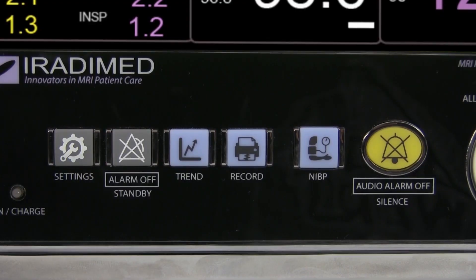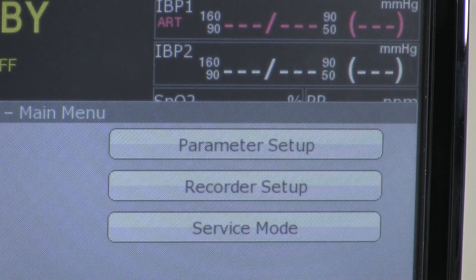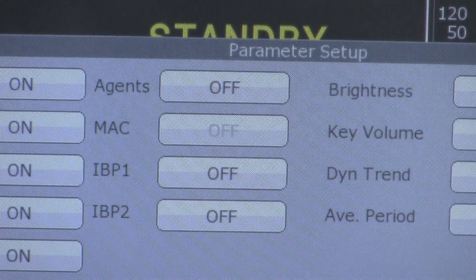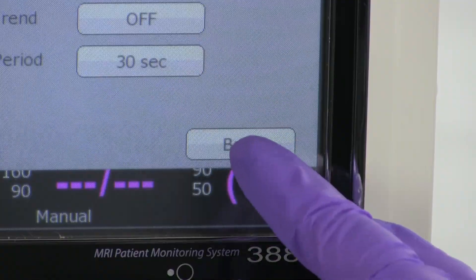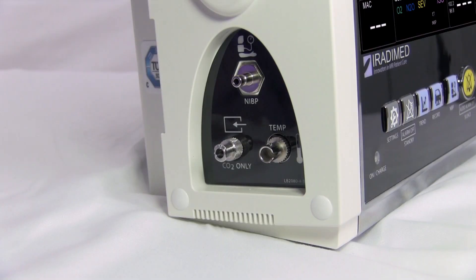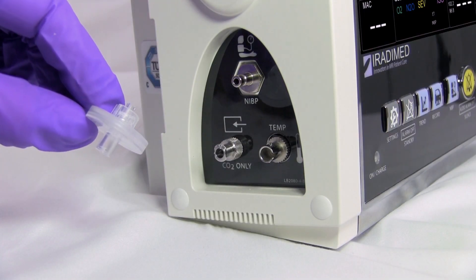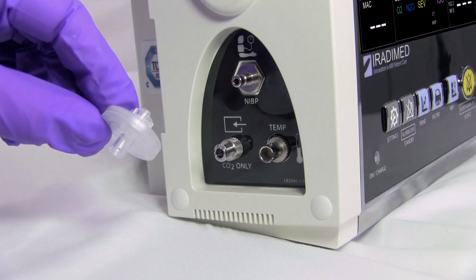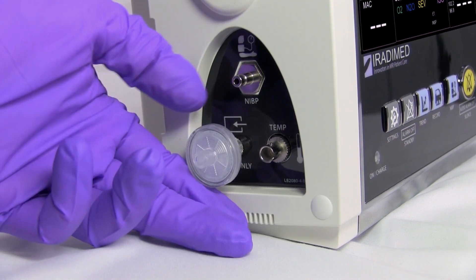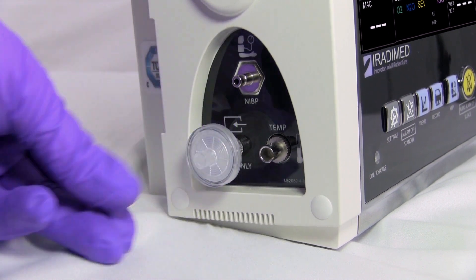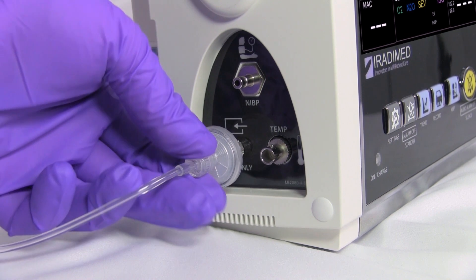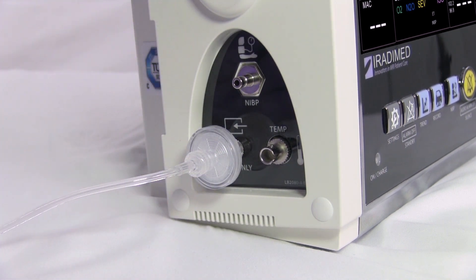To do this, the user will press the settings button, click the parameter button, and press the box located next to agents until off is shown. The user will then press the back button twice to return to the monitor screen. Next, connect the disc filter to the CO2 accessory port on the monitor by inserting the male connection to the female port and rotating clockwise one half turn until it stops. The user will then take the male connector of the sample line and secure it to the female connector of the disc filter.